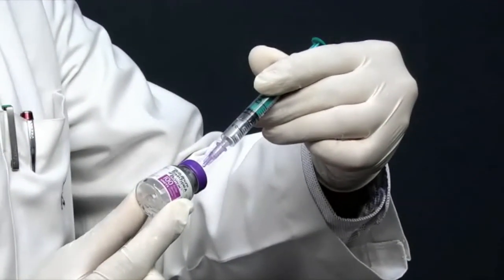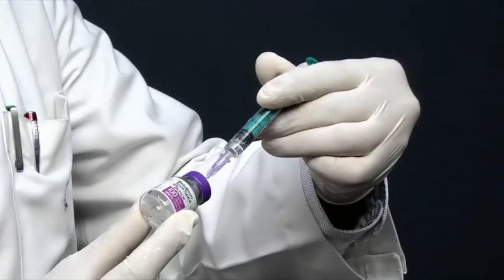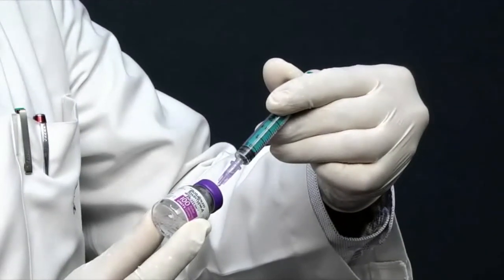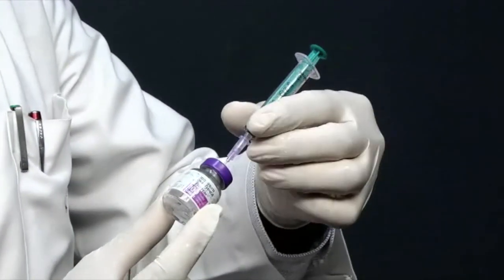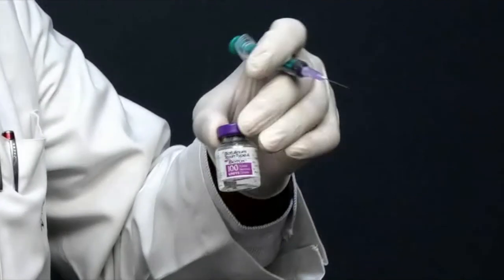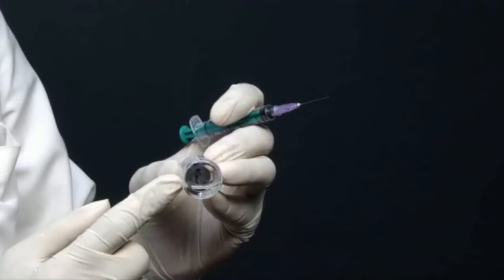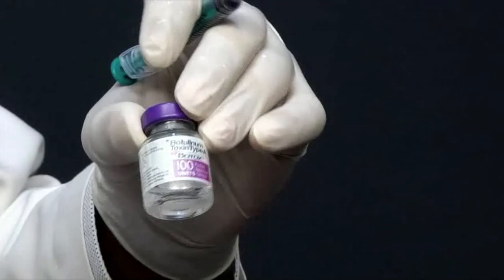You do not want to create too much turbulence within the vial because this molecule needs physical stability when you are reconstituting. You can see that the vacuum within the vial has sucked in all 2 cc's of preservative-free saline. Once that is done, very gently swirl the bottle so that the entire drug is mixed, and that initial layer of powder we saw at the base is now fully dissolved and ready for injection.